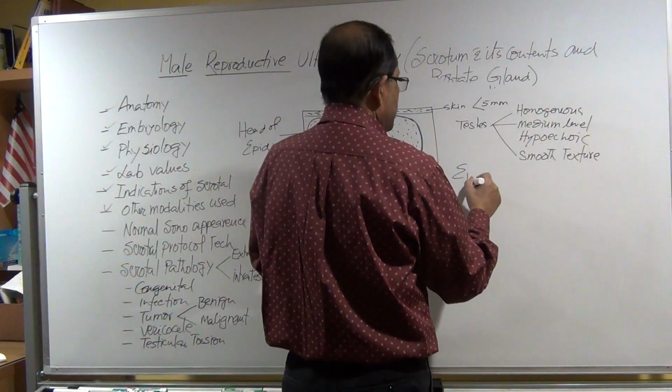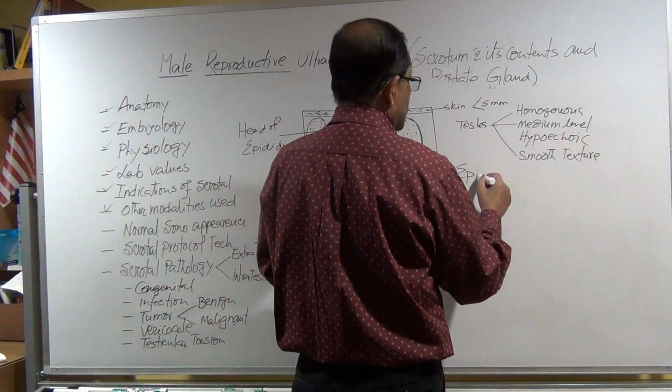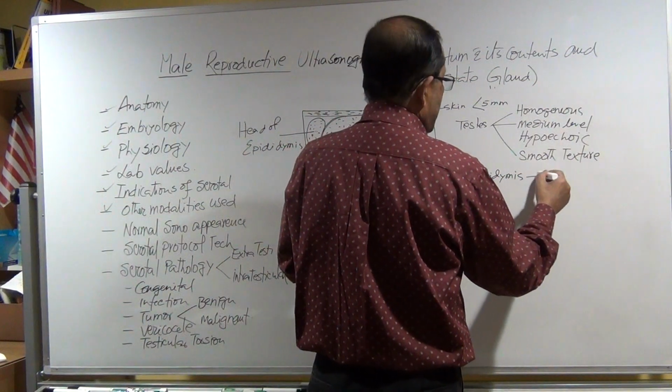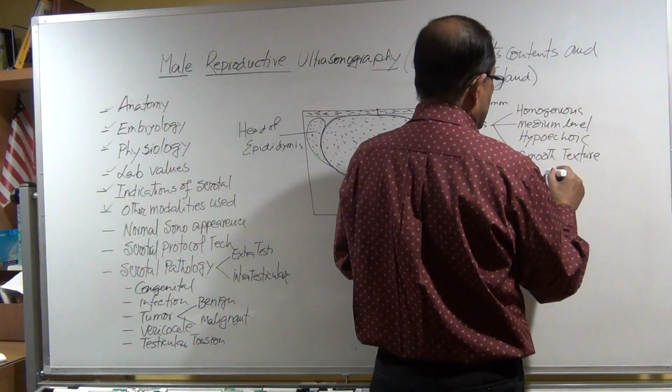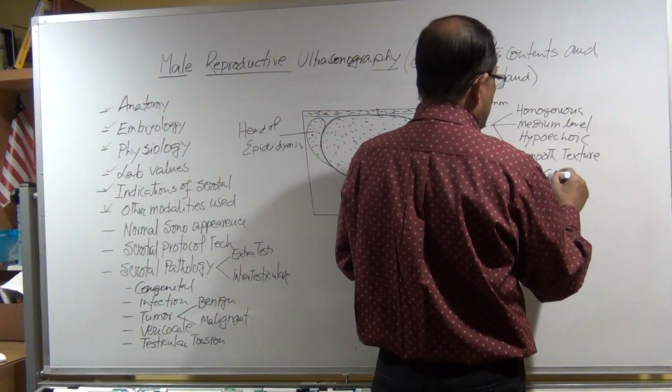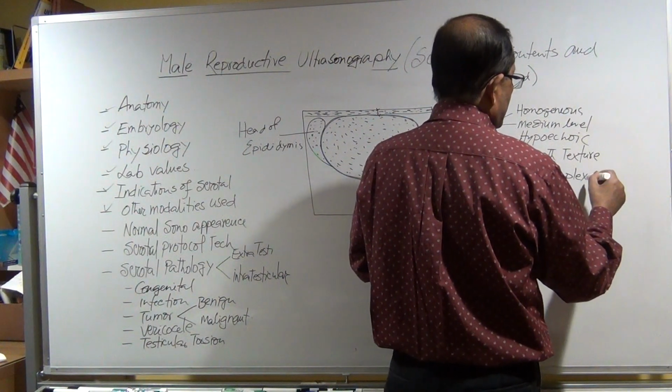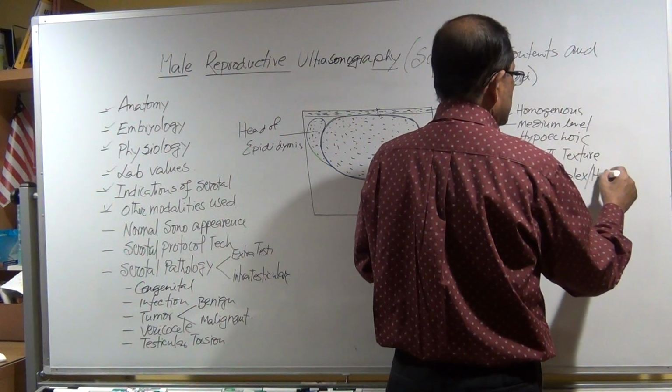And epididymis is complex looking or heterogeneous.